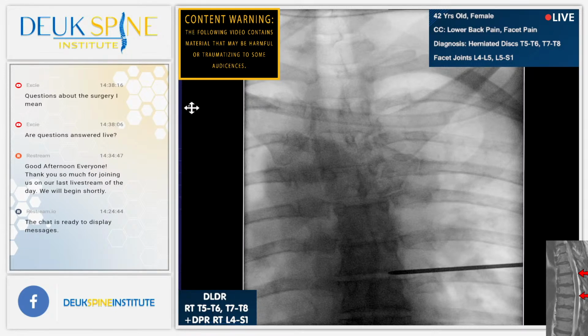All right, let's just say that's T1, 2, 3, 4, 5, 6, 7. So let's see. T1, 2, 3, 4, 5, 6. We're right at 7. Should be 7, 8.